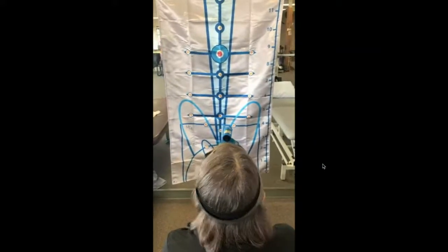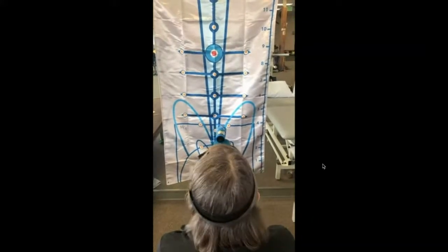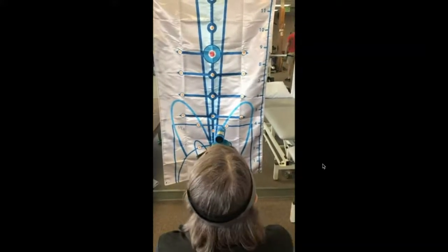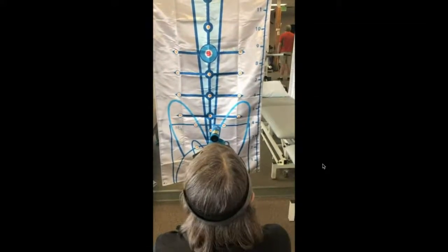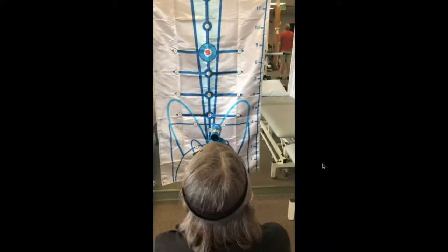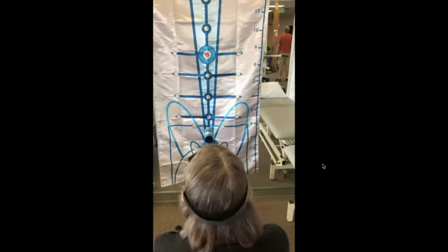She's looking at the orange target, and this is just a practice run of her understanding how far she needs to go to the right to have equal motion. And she just doesn't like to do it. So you'll see her pause a little bit and say, hey, I got to really get over there. It's really easy to go to the left side. It's much harder to go to the right side.